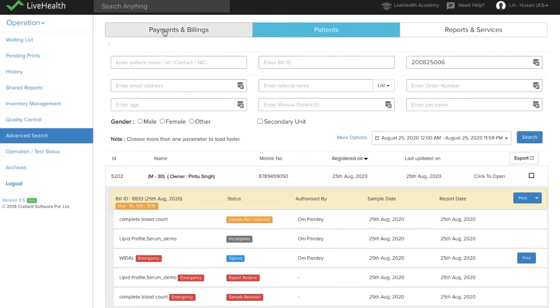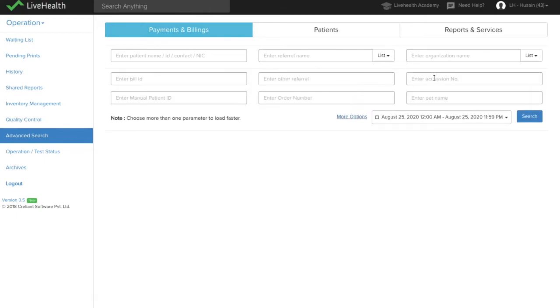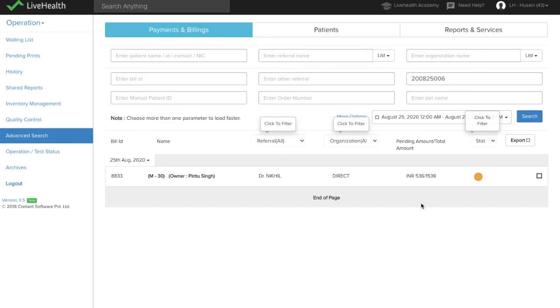Similarly, you can search the bill of that patient using the same accession number and you can see the status of the bill and you can even print the bill from here.